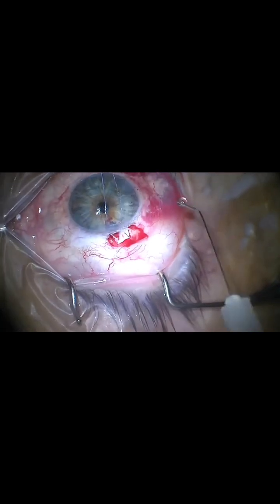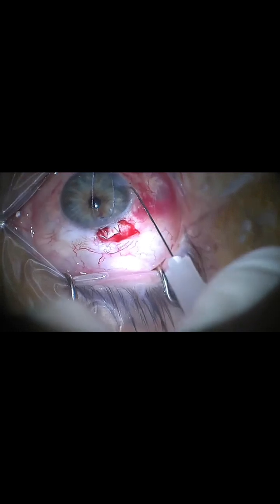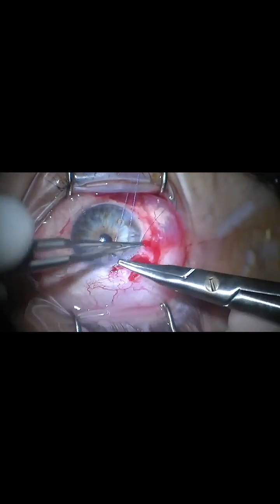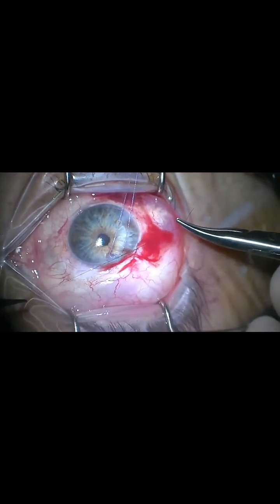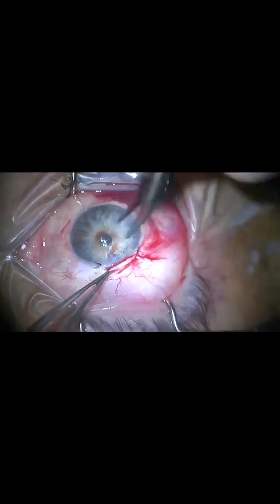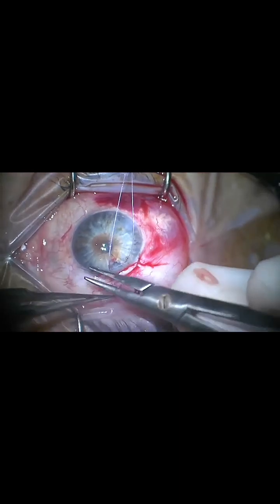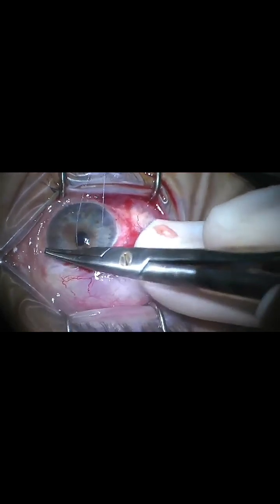BSS is injected into the anterior chamber with adequate flow through the flap and stabilization of the anterior chamber. Here, the conjunctiva is advanced to the limbus and closed using 10-0 nylon wing sutures. Long passes are preferred here to allow for easier rotation and burying of the knots. Nasally, you'll see an area of redundant conjunctiva that's secured in a running fashion with 10-0 nylon suture, which ensures a watertight closure.